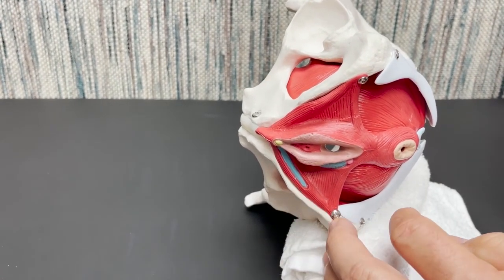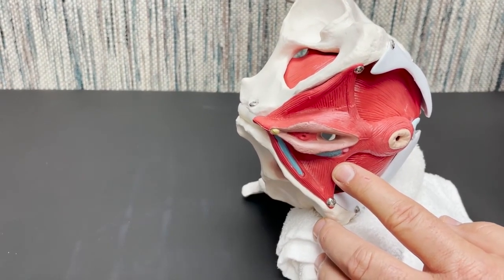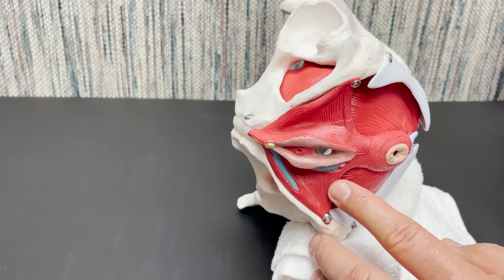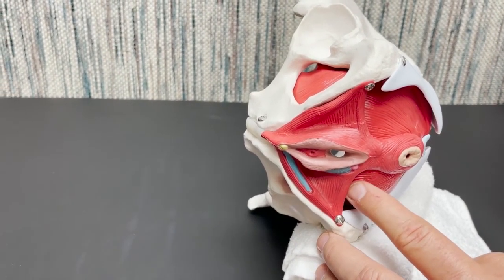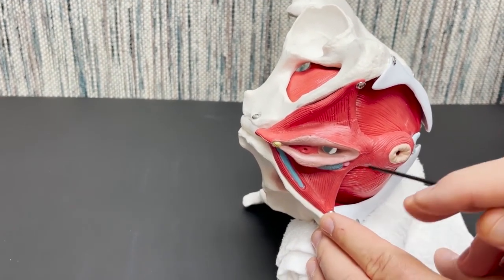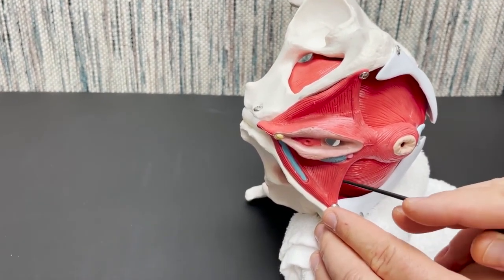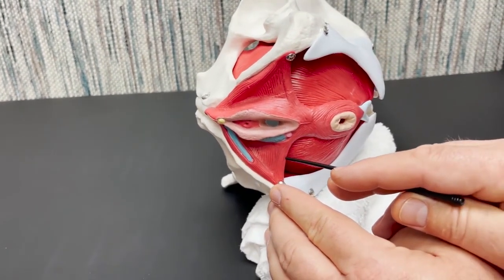So we find an ischial tuberosity, our perineal body. We can palpate and have our patient perform a pelvic floor muscle contraction to locate the transverse perineum, both superficial and deep at the same time. Needle point will be at midpoint between perineal body and ischial tuberosity, and we're going to needle away from our internal organs.